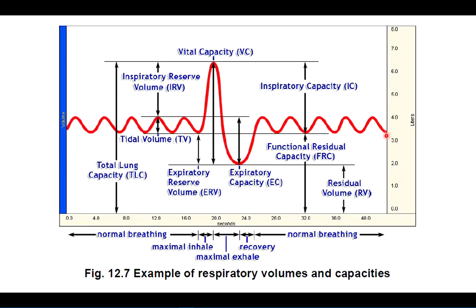Now on this figure, we see a number of different components, and this is what you're going to be analyzing in this week's laboratory experience. As we look at the person's tidal volume, you'll notice that we have these up and down strokes, and we have this series of arrows right above the label tidal volume. So if we were to measure from the top of these peaks to the bottom of these peaks, this distance or volume of air would be our tidal volume.